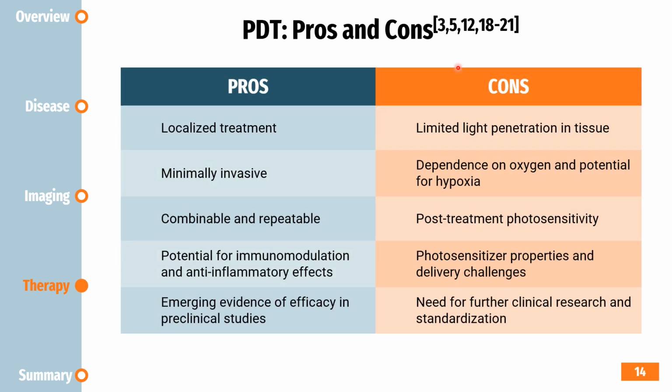Photodynamic therapy for ulcerative colitis has several benefits. It targets specific areas, is minimally invasive, can be combined with other treatments or repeated, and may help reduce inflammation and modulate the immune system, with early studies showing promise.